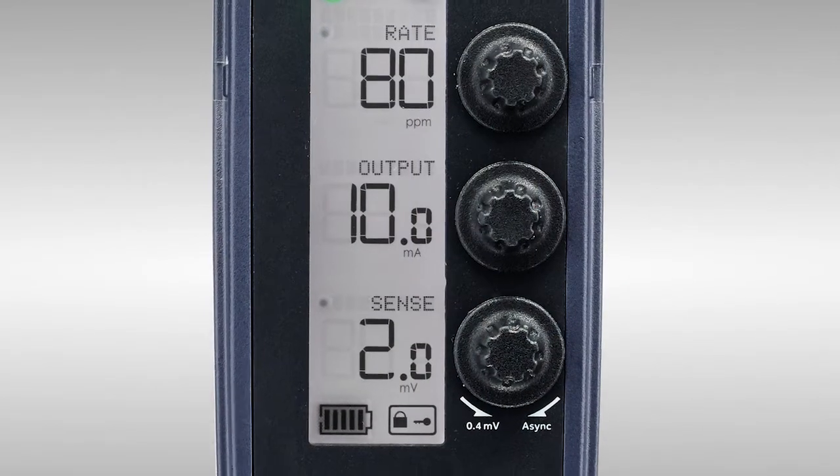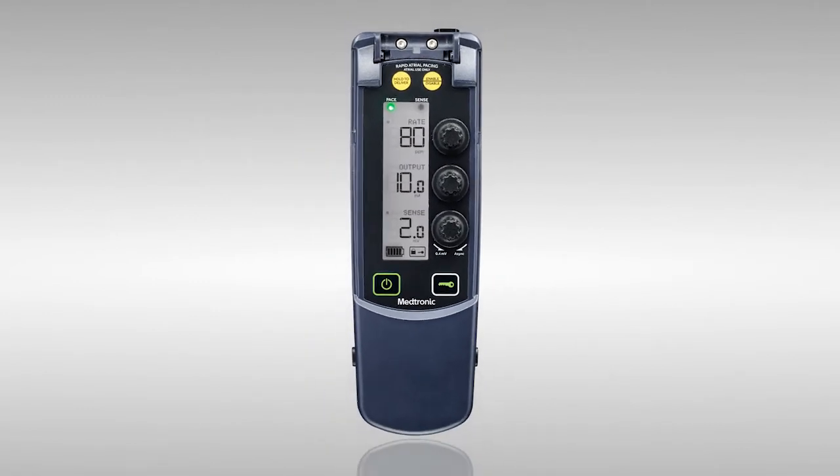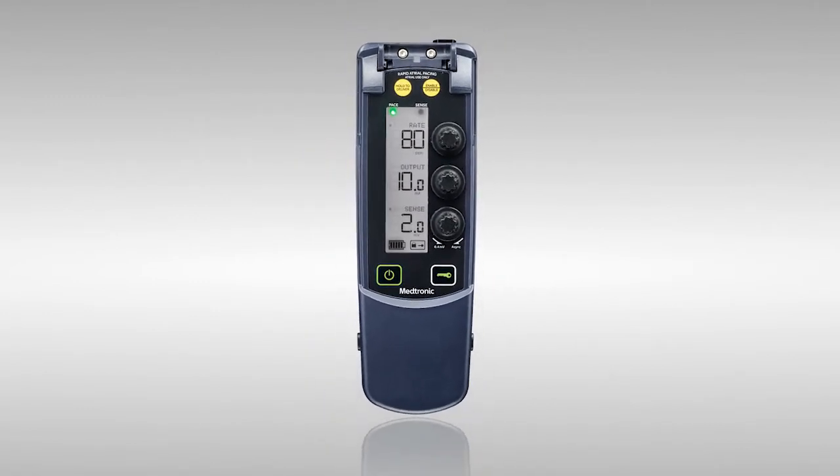Good morning, Christy. Thanks for taking the time to see me. How are you doing? I'm good. Thanks for coming. I'm excited to learn more about the 53401 Temporary Pacemaker. Yes, it's Medtronic's single-chamber Temporary Pacemaker, and I can't wait to show you its features and how it can benefit you and your patients. It's a durable and damage-resistant device that's easy to use. I'll start by reviewing the physical features.